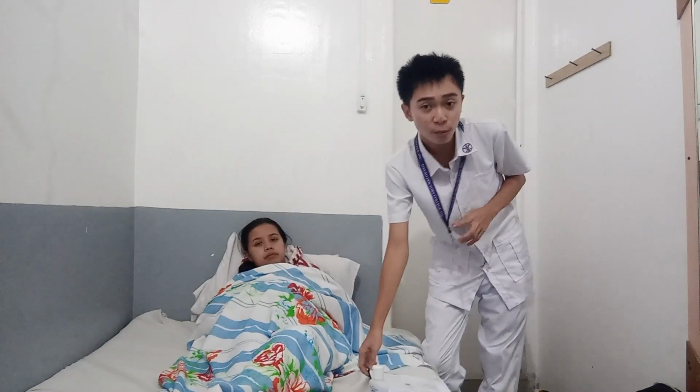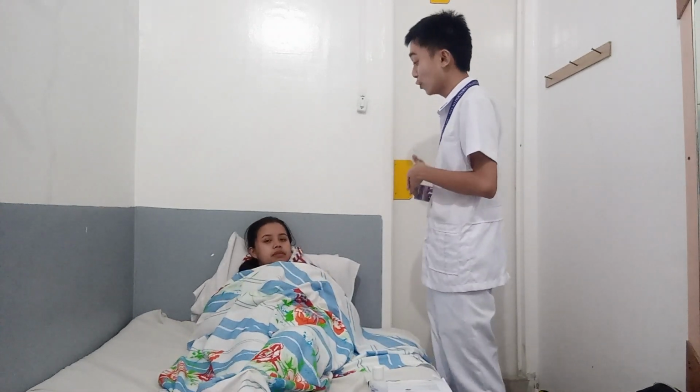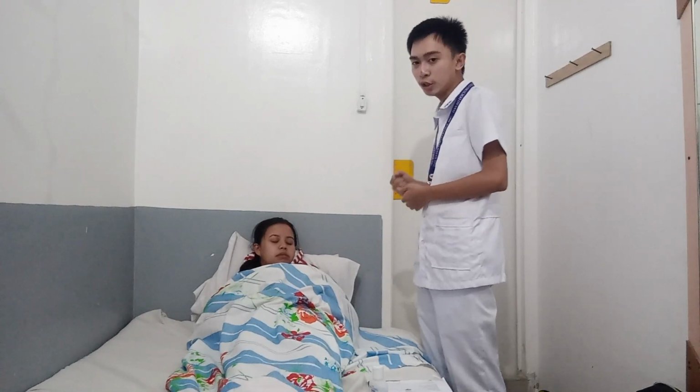Explain the purpose of the medication and how it will help, using language that the client can understand. Include the relevant information about the effects of the medication. Ma'am Chris, today I will be administering your insulin. Insulin will help your body control your blood sugar, as you have type 1 diabetes. I'll be injecting your insulin in the subcutaneous layer of your skin over your shoulder. Is it okay with you, Ma'am Chris?